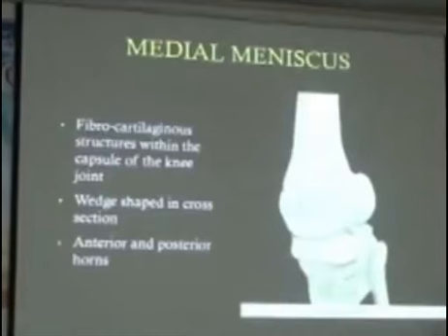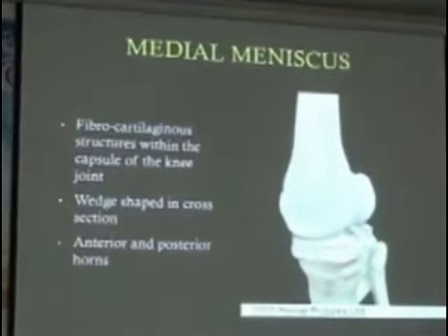So the medial meniscus is just this fibrocartilage, and it's a little shock absorber that sits in between the two bones.